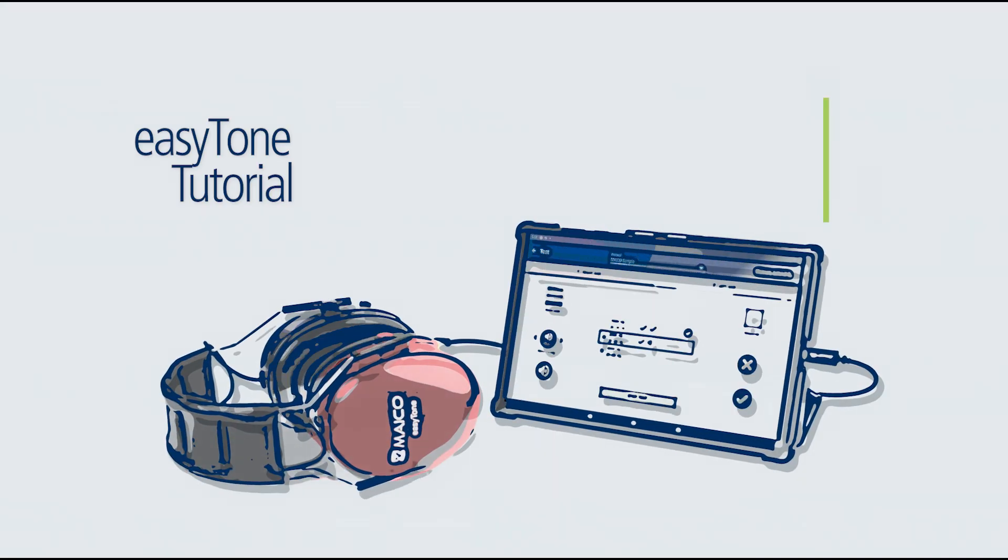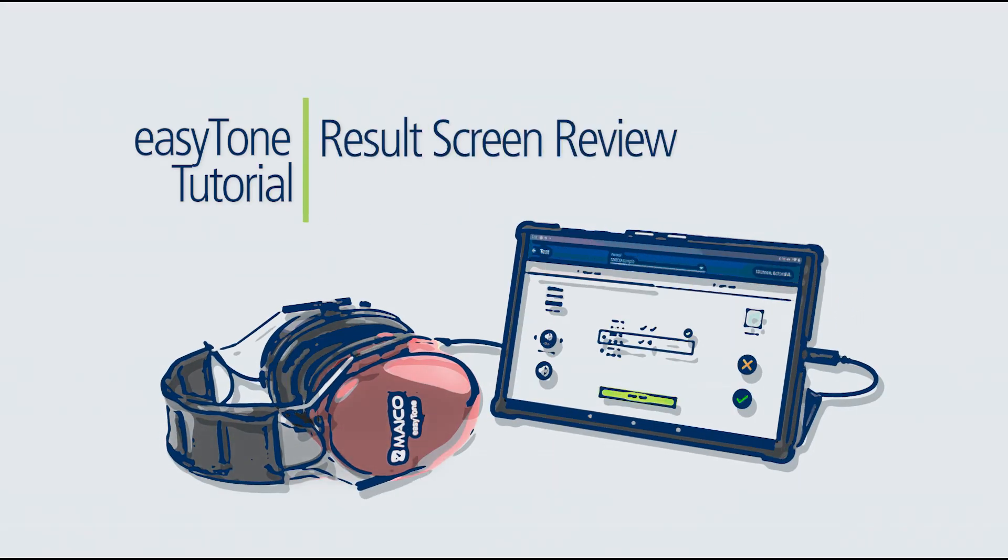This completes the tutorial on result screen operation. Please continue through the tutorial series for additional easyTone instruction.